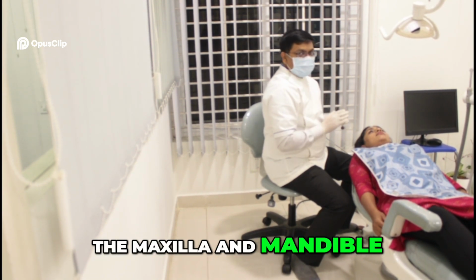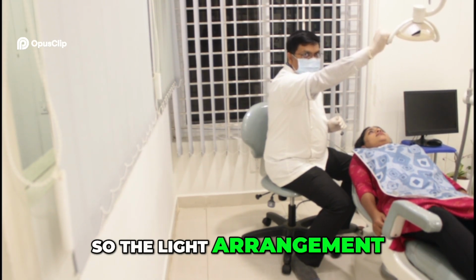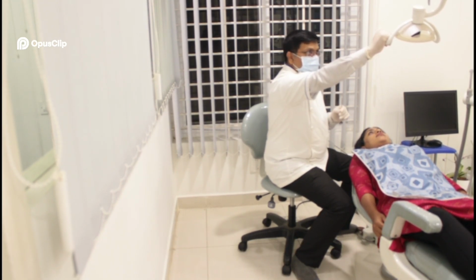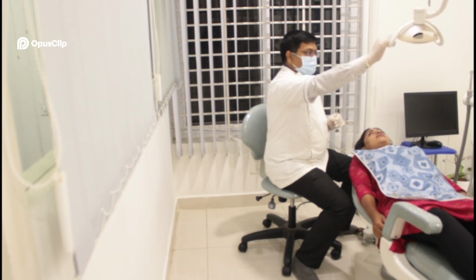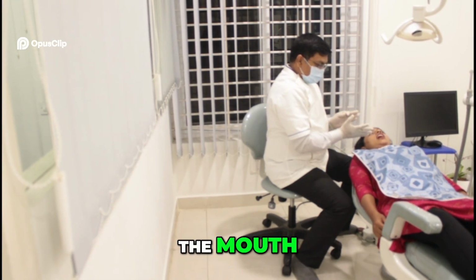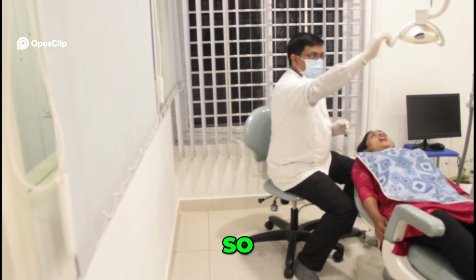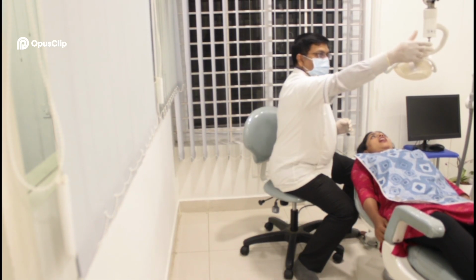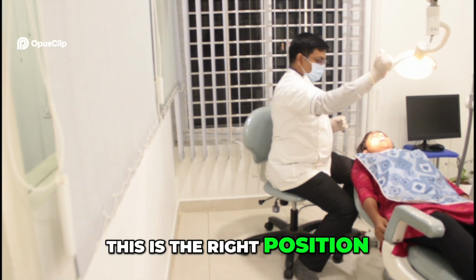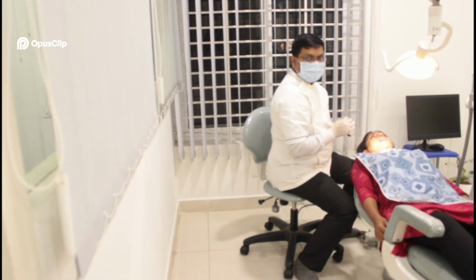The maxilla and mandible are in different planes. So the position of the light also changes for maxilla and mandible. When the patient opens the mouth, this is the maxillary plane. Open, please keep it open. So if I have to adjust the light for the maxilla, this is the right position. The light falls directly on the maxillary occlusal plane.